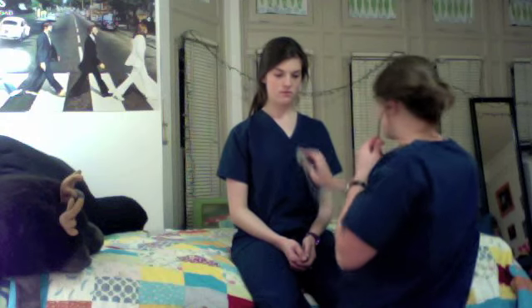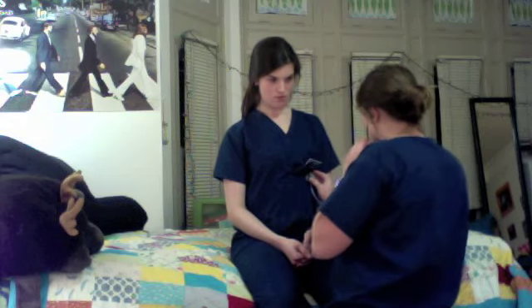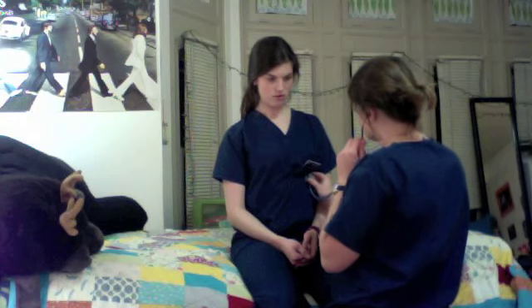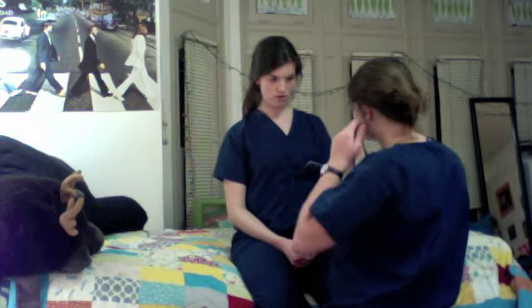And last, we go to the mitral, which is the 5th intercostal space, mid-clavicular line. And this is where you hear the S1 or the lub. And I don't hear any murmurs, so you're good.